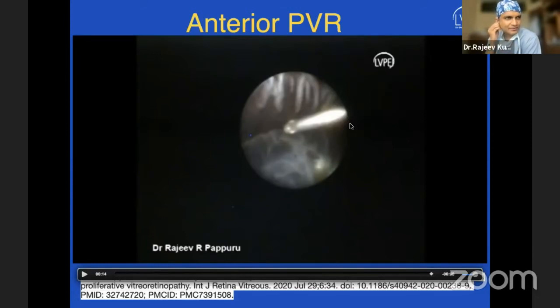So this would reduce the amount of retina which you might end up cutting. So you'll be able to identify those areas, especially in RDs with PVRs where you feel that the periphery cannot be examined with some corneal opacities, and maybe in IOL where there is little haze because of the PC opacity in the periphery. All those cases where you wanted to see the periphery better than what you were seeing before. There's an advantage of having an endoscope when doing retinal detachment surgery.